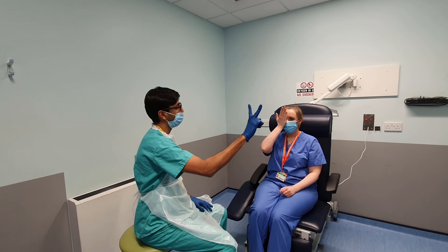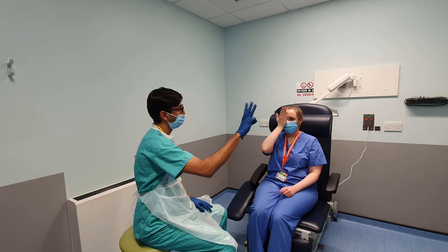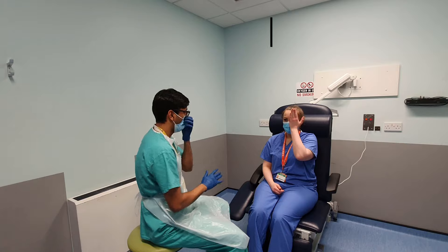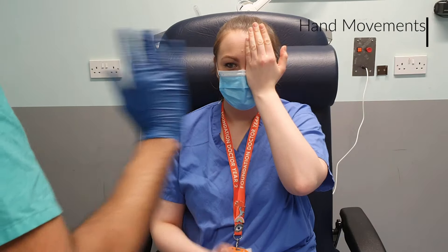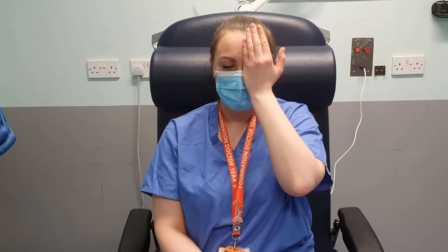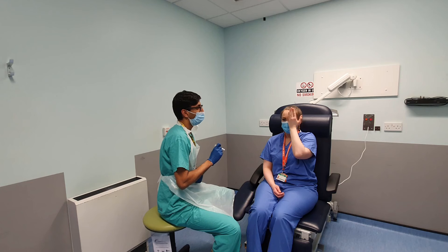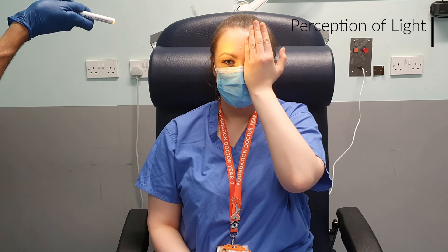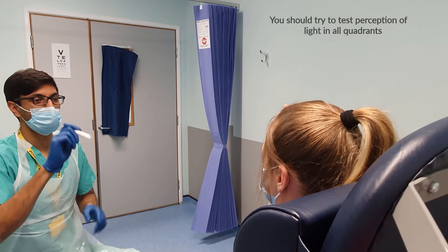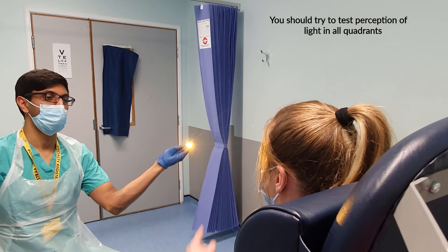If the patient still can't see, you should test the ability to detect hand movements. Ask them to tell you which way your hand is moving: 'Which way is my hand moving now?' If less than this, you can test for perception of light using a bright light source. If the patient is unable to see the light, this will be documented as no perception of light.